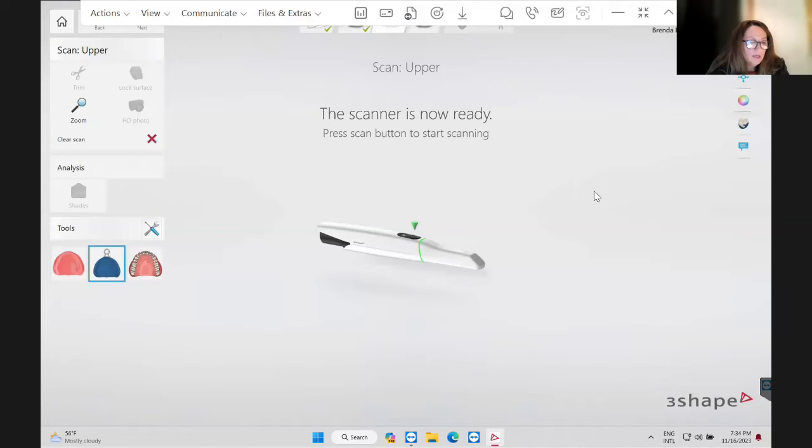So if it has not been relined, if you look at acrylic, it's thin, right? So I can hold it up to a light and light will pass through, but this powder has helped quite a bit with that lower. So if you are trying to scan a copy denture and you don't have a liner or a contrasting spray, you're going to want to hold a glove underneath it so the light doesn't pass through and create odd holes.